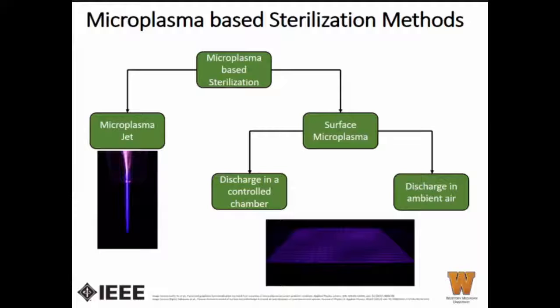Surface microplasma can be in ambient air or in a controlled chamber. When a control chamber is involved, again, it makes it bulky and more expensive. So our focus is using microplasma discharge devices and using air as a sterilization agent.